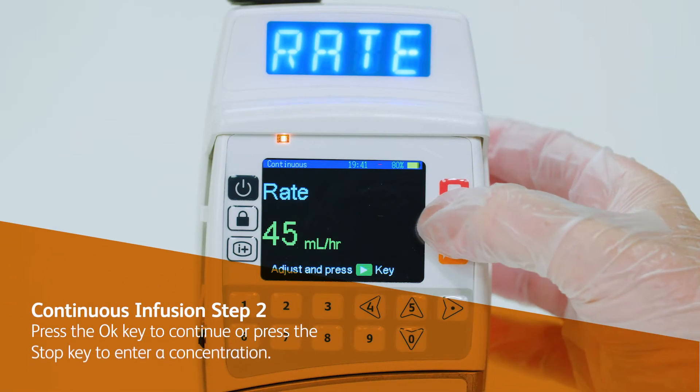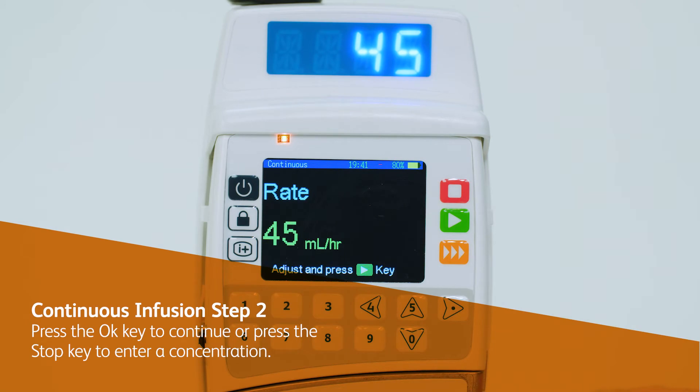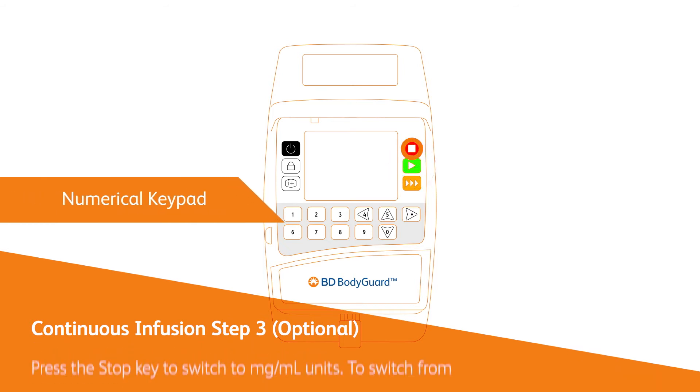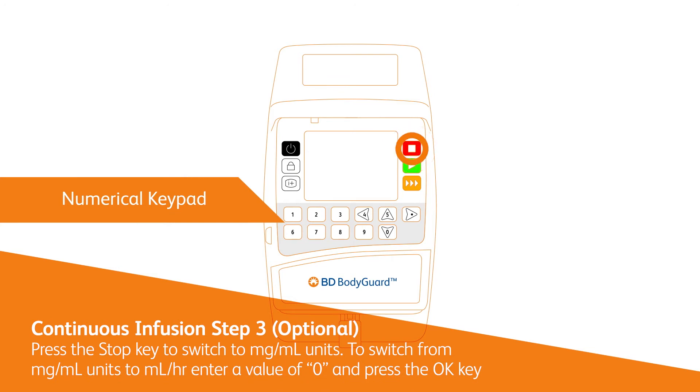Press the OK key to continue or press the stop key to enter a concentration. Enter the concentration and confirm with the OK key. Press the stop key to switch to milligram/milliliter units. To switch units to milliliters over hour, enter a value of zero and press the OK key.